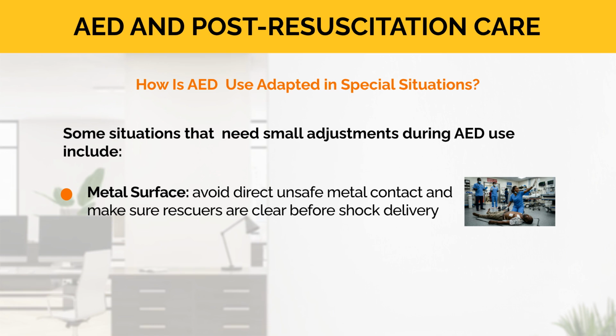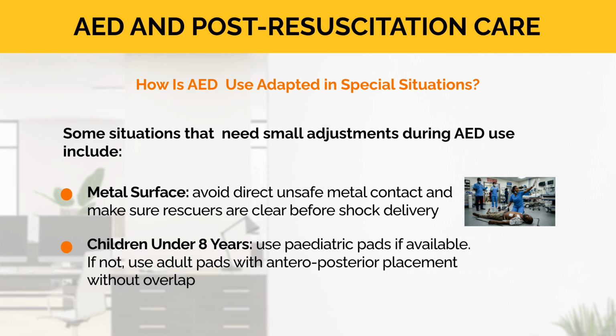Metal surface. Avoid direct, unsafe metal contact and make sure rescuers are clear before shock delivery. Children under 8 years. Use pediatric pads if available. If not, use adult pads with antero-posterior placement without overlap. Note: special situations require adjustment, not delay.